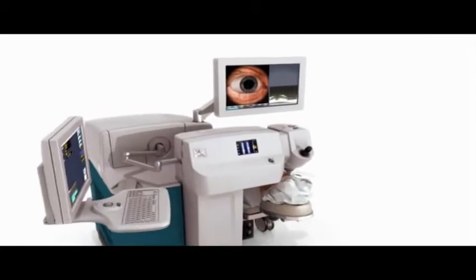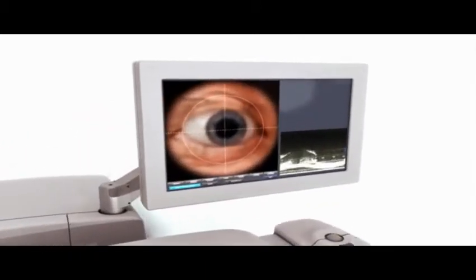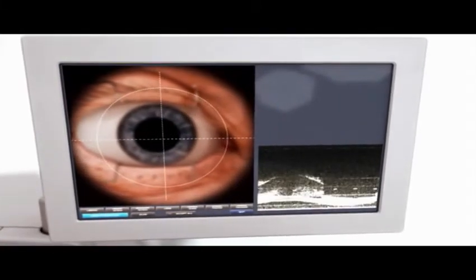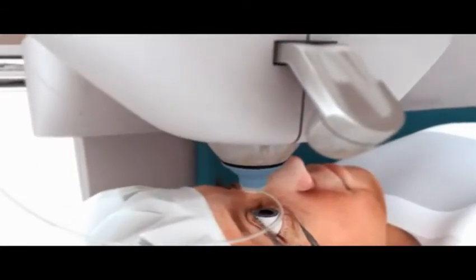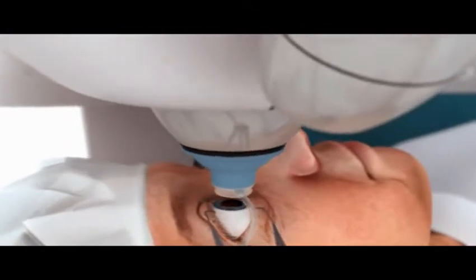The ZEISS refractive cataract surgery experience featuring real-time imaging and integrated OCT. The LensX laser allows for visualization of the entire anterior segment during docking, planning, and procedure. The patient relaxes as the surgeon utilizes the high-resolution video microscope.